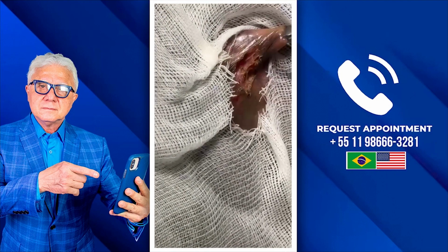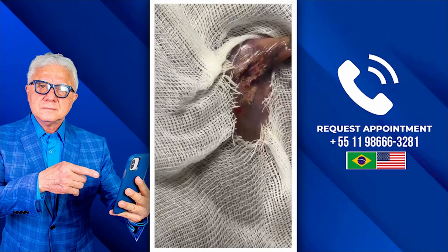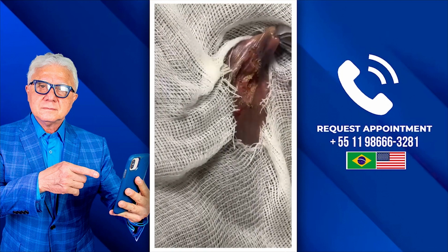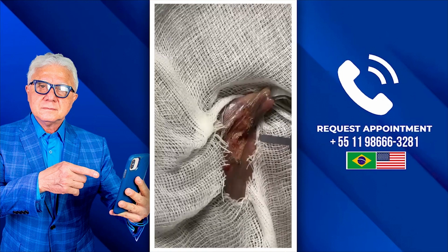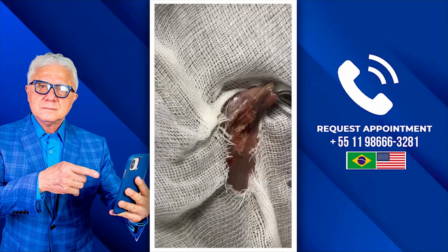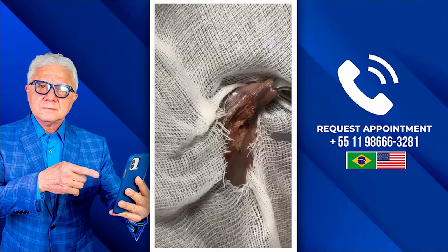Through this, I will lower the pressure of the anal muscle. In one surgery, I remove the hemorrhoid, remove the fissure, and here with the laser, I lower the pressure of the anal muscle. Understood? Local anesthesia, light sedation, and then discharge.